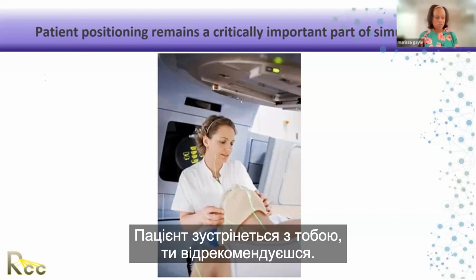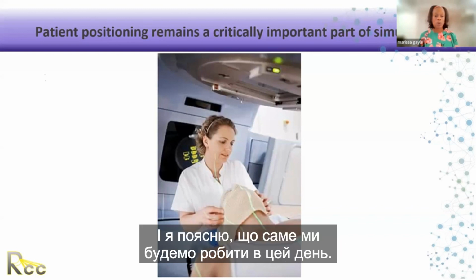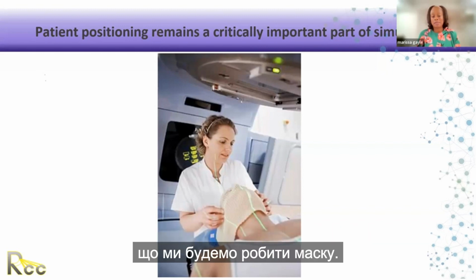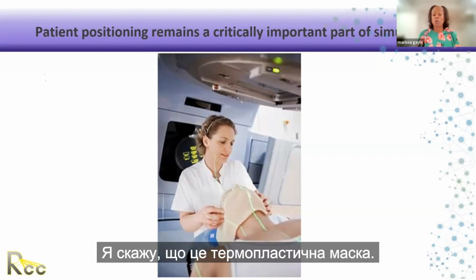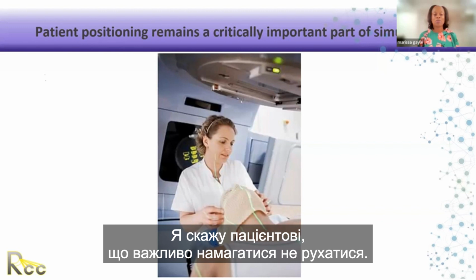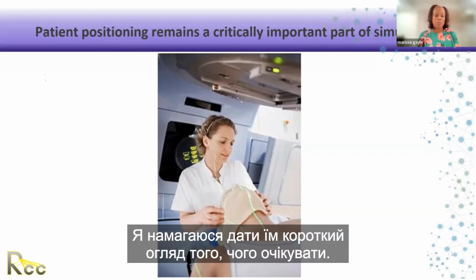The patient's going to meet you. You're going to introduce yourself. I'll say, hi, my name is Marissa. I'm your radiation therapist. And I'm going to explain exactly what we're going to do that day. So if we're making a mask, I'll let the patient know we'll be making a mask. I'll let them know that it's a thermoplastic mask, and when it's touching their face, it may be warm, but it will cool quickly. I'll let the patient know it's important to try not to move. I'll let them know that they'll get tattoos and they'll get pictures. I try to give them a brief overview of what to expect.